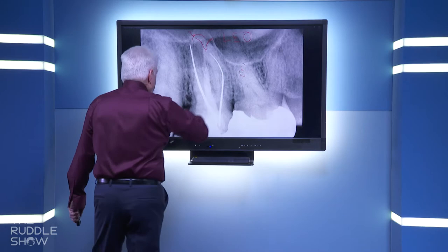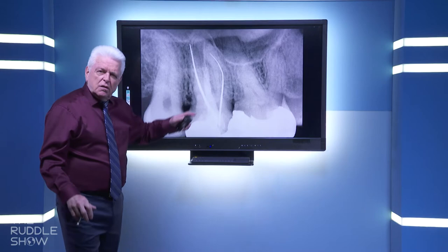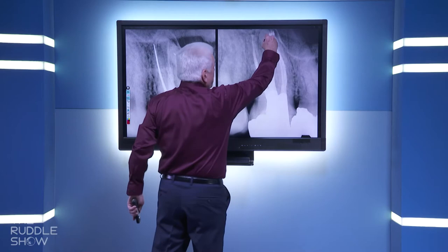It's not properly shaped. It's pretty much a parallel canal. I think the minimally invasive dentist would just love that shape. If they could just imagine, I love this word imagine, we're going to reimagine. It's not a silver point, it's BC Sealer. Now you're loving it. It's a nice skinny shape with BC Sealer. All right, and so a little endodontics, improve the shape, get the length. Notice that abrupt curve we made, it goes just like that.